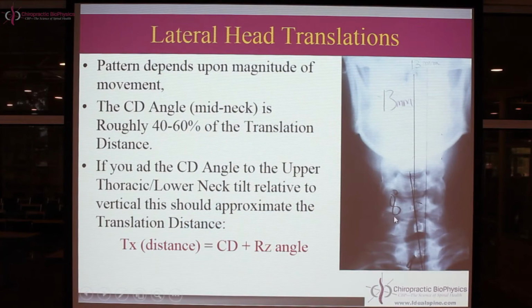It's still within normal limits, but it's on the high end of normal. So I'm not overtly concerned about trauma in the cervical spine, like the joints being truly injured, like ligament damage. However, this is a complex posture where the person's head and neck are stuck in this position. And over time, that angle might actually get bigger. And if you look at what we did last week in week 12, we've shown over time, these things might actually get worse in patient populations, okay? So 8 degrees, roughly 60% of that 13 millimeters.